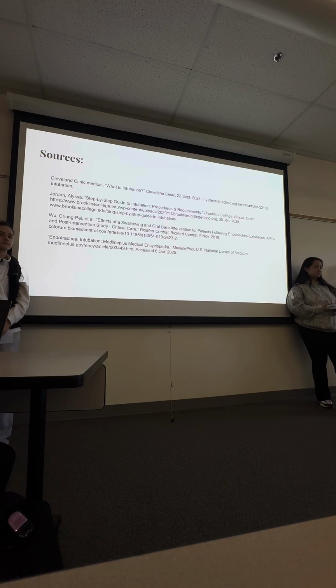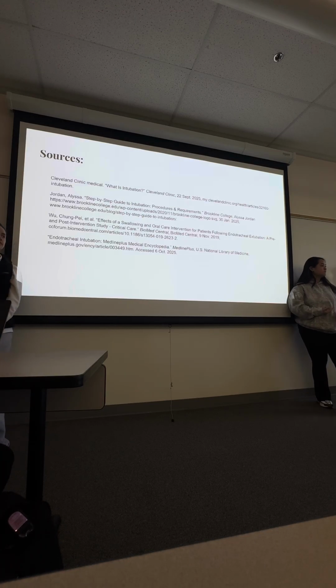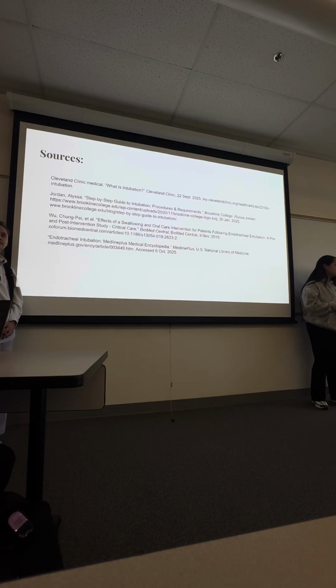They're actually going to measure the tube. They're going to put the tube on the outside of the person and measure from the mouth down to the sternum. You don't want to go beyond the end of the sternum, because that's about how far intubation goes. So you want to measure the tube lengthwise. And then, of course, if you're doing a lot of intubation, you would have a sense about what size tube you're going to use. In veterinary medicine and human medicine, you have babies, children, and young adults, so you have different size tubes for all of those situations.